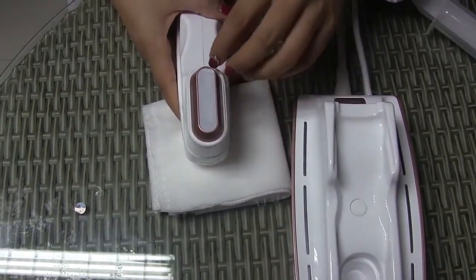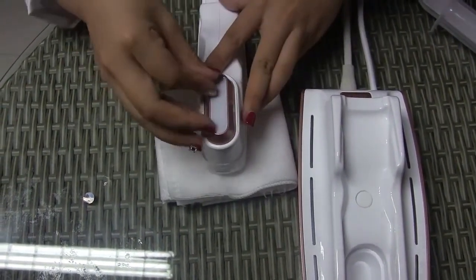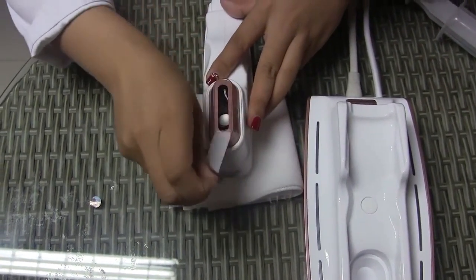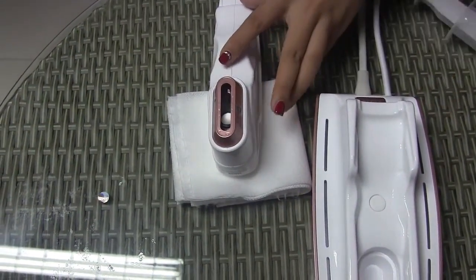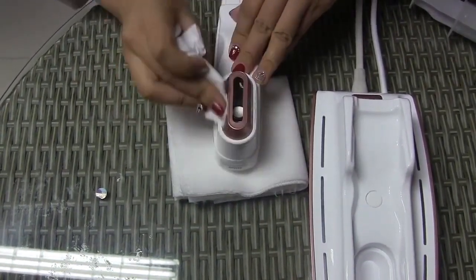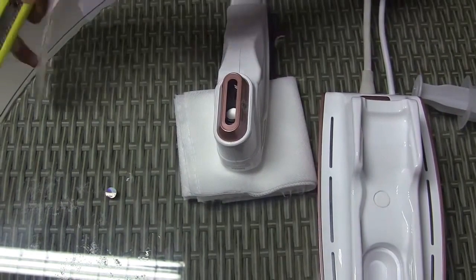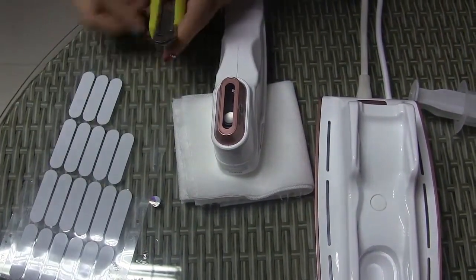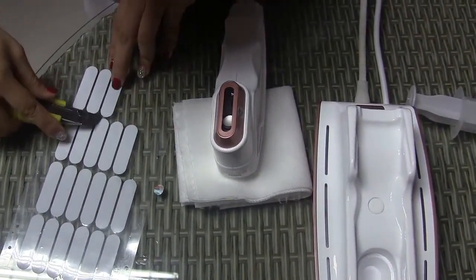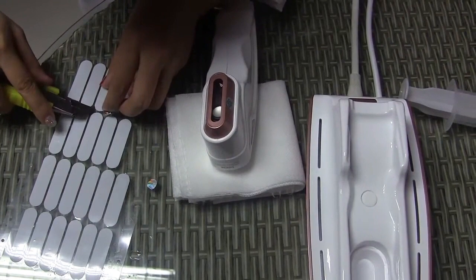When you see this membrane has the scratch, scar, or configuration, you can change it. Firstly, we need to tear it off. Wipe the water. And we get the membrane. We can use something sharp like the knife to get the membrane without damaging it.